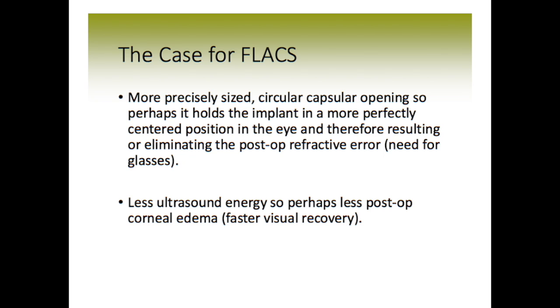And then the second thing they talk about is that less ultrasound energy is required since the lens contents are softened by the laser, and therefore you may have less postoperative corneal edema. And if you have edema in the cornea, that's almost always just temporary, but it could cause some foggy vision in the beginning, and so this way you may have a faster visual recovery if less energy is used.